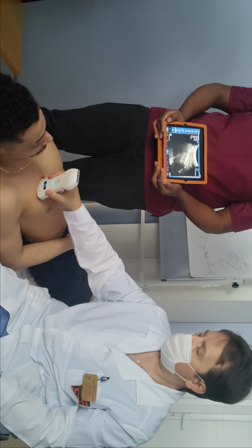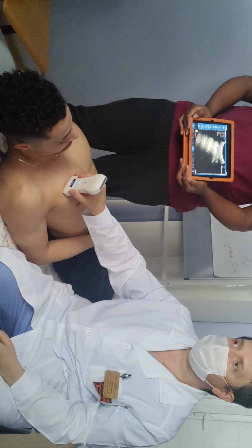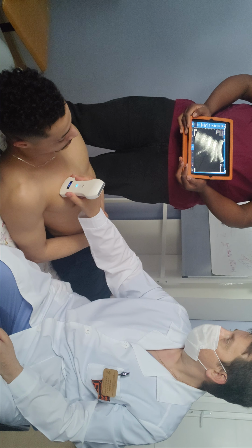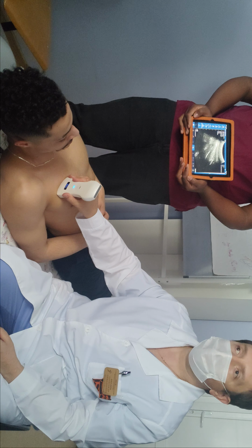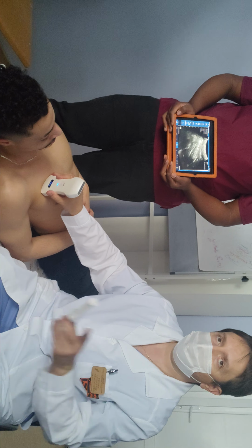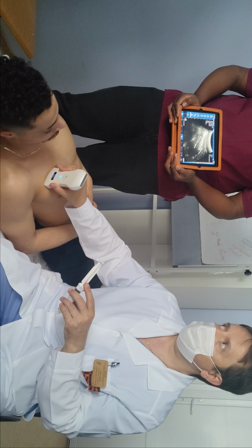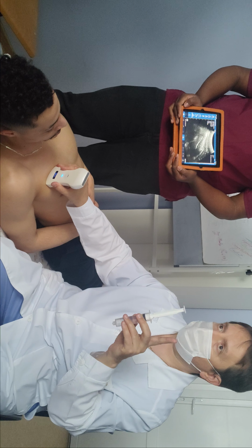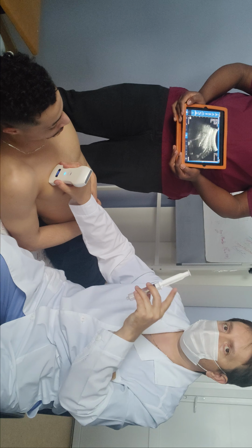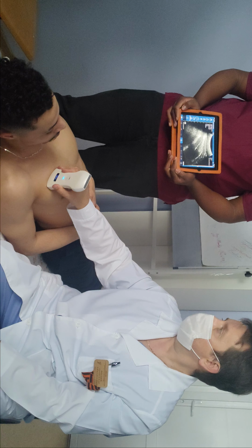If your patient, your colleague, will take a breath, do it. We see the movement of the lung, you see? Nice. Those horizontal lines we call A lines. They are normally present everywhere in the lungs. If we see the vertical ones, we call them B lines. They can be present, but no more than one or maybe two. A big amount of B lines, vertical lines, means that your patient has inflammation.